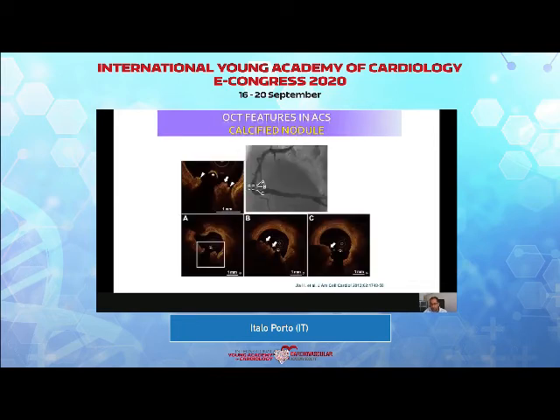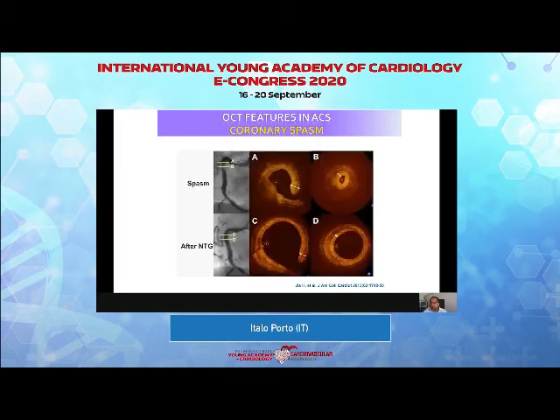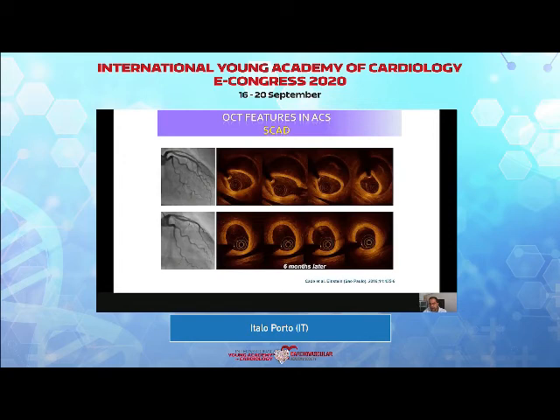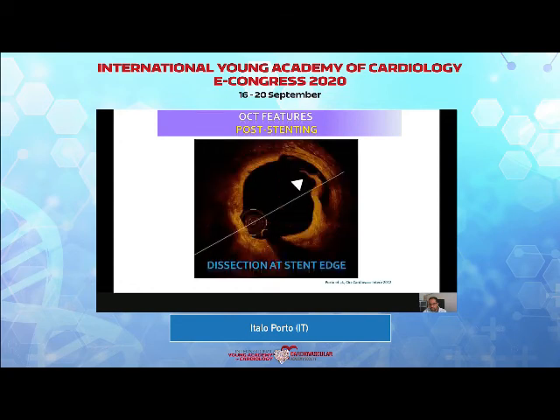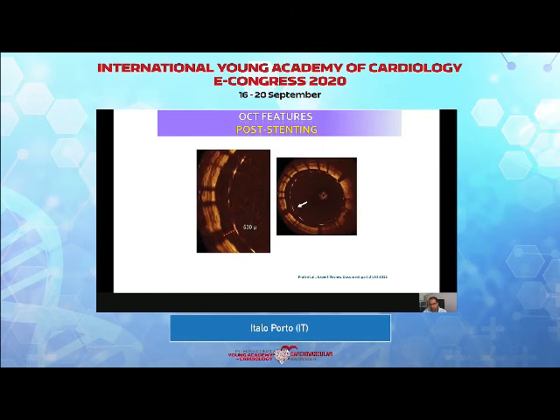Rare causes of ACS such as calcified nodules can be identified — they are associated with ACS when thrombosis is also visible. Coronary spasm has a specific appearance on OCT. You can also identify features typical of spontaneous coronary artery dissection, or SCAD, because you can see an intramural hematoma and sometimes flaps. After stenting, OCT allows you to see intra-stent thrombosis, intra-stent dissection, tissue prolapse, and malapposition, including measurement of malapposition length in both longitudinal and axial slices.